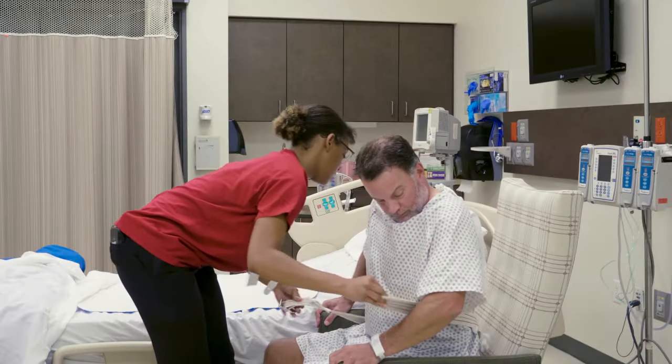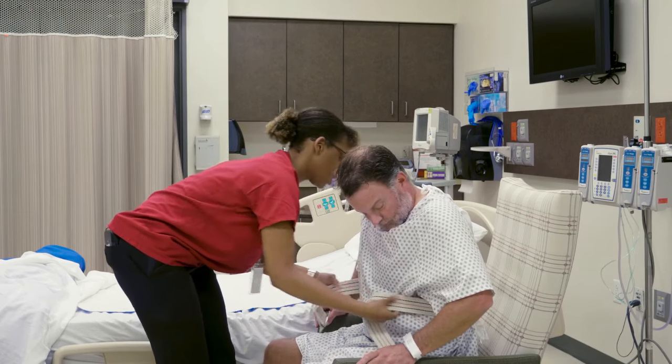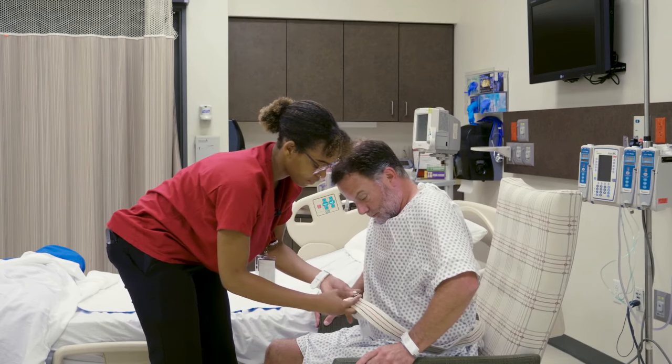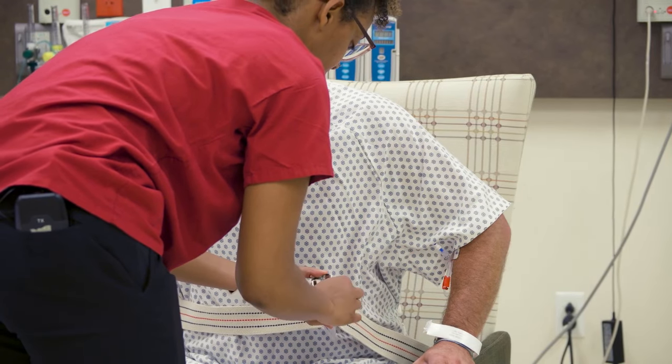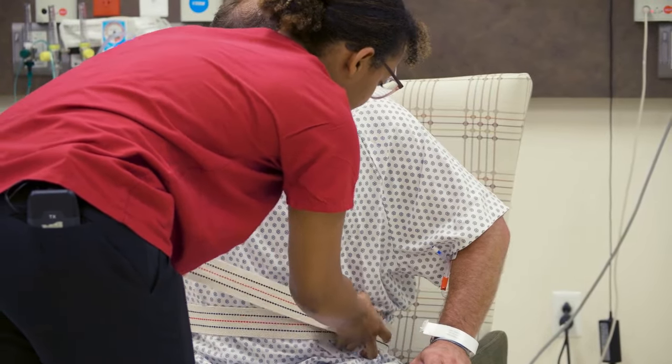Apply the belt snugly around the waist over the person's clothing. Be careful not to over tighten — the belt should not cause discomfort. Place the buckle off to the side; do not position the buckle over the person's spine. Tuck any excess belt strap into the belt.